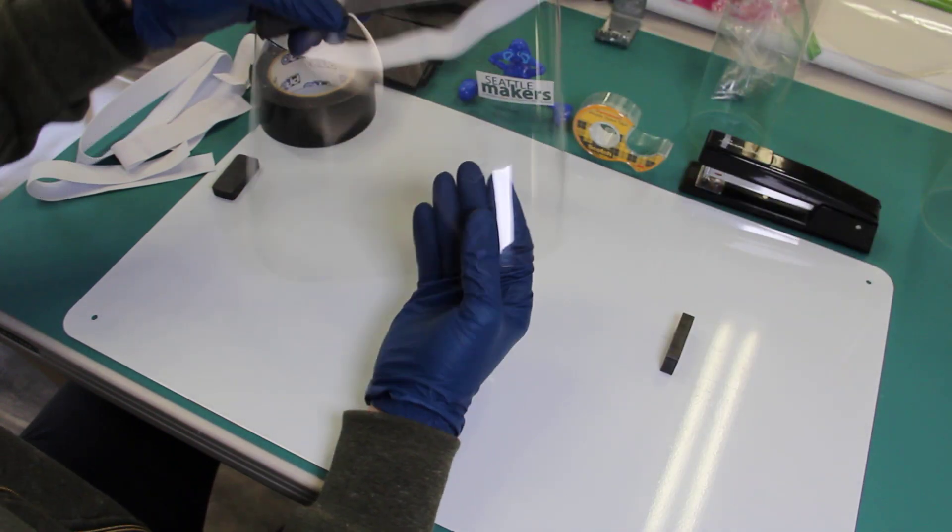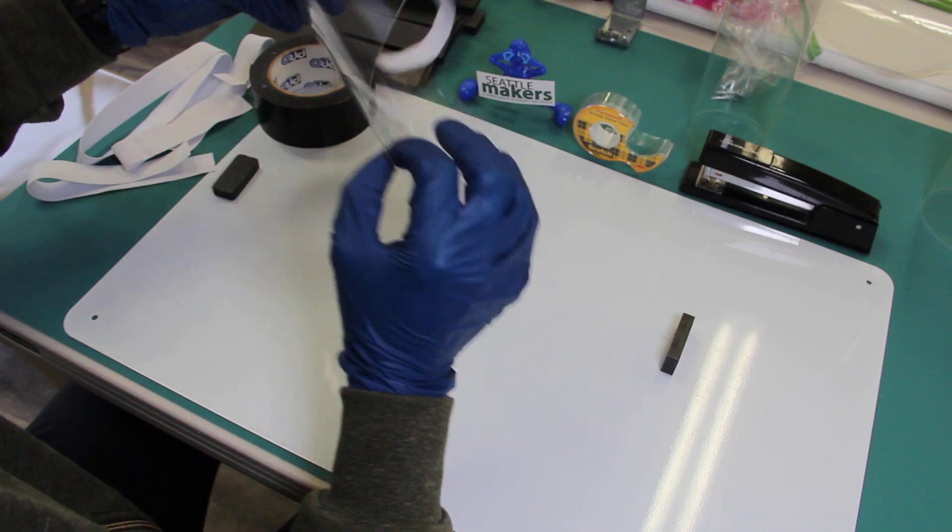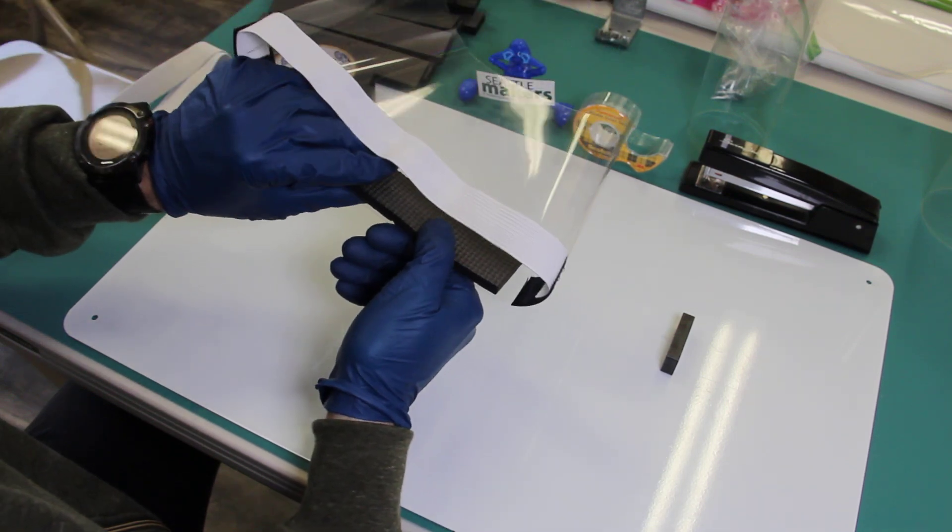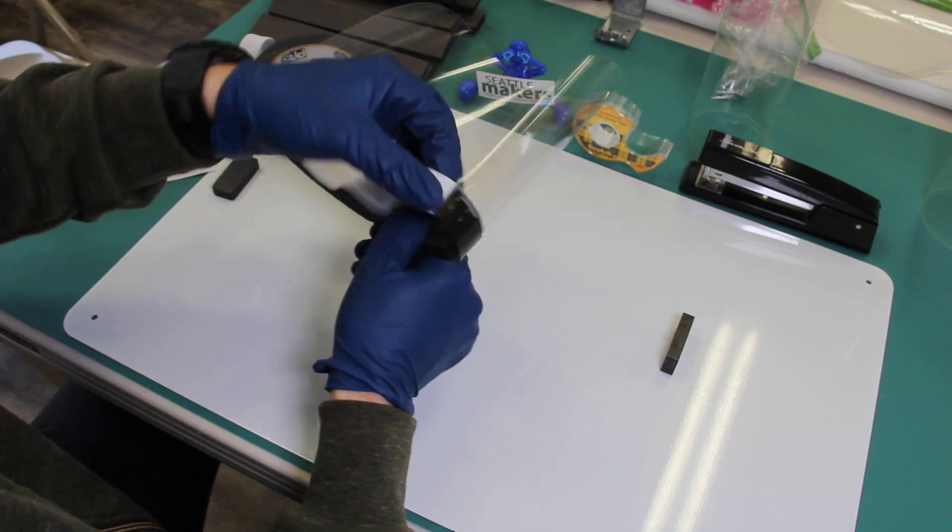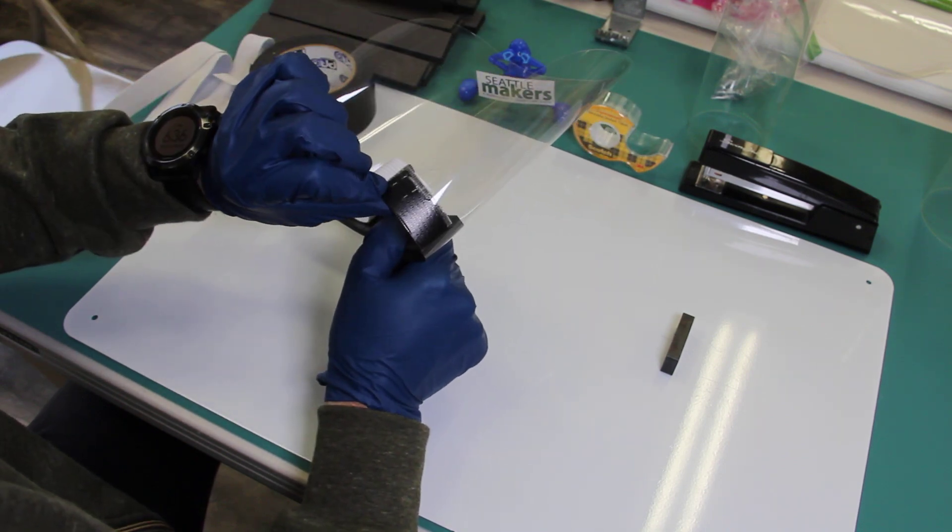So these are made from .007 inch Mylar sheet, EVA foam for the top part, one inch elastic, some duct tape, and a couple of staples.